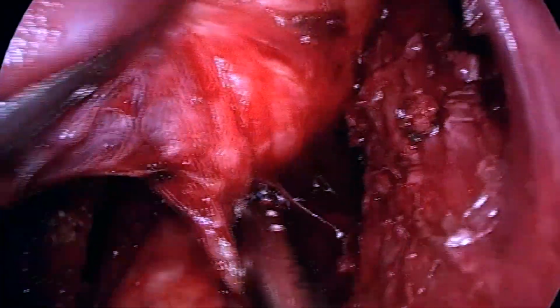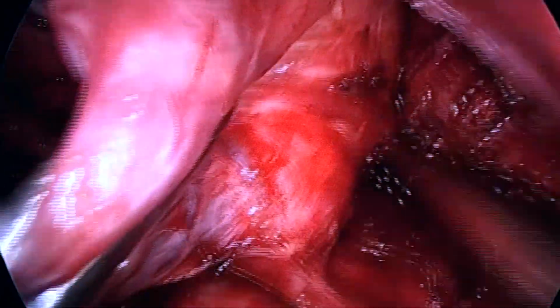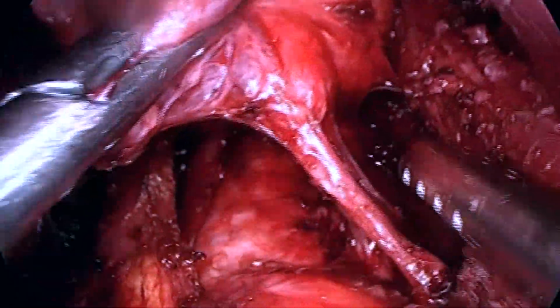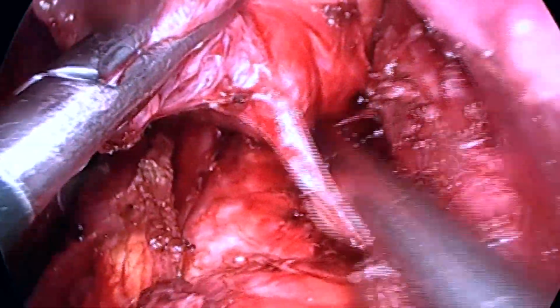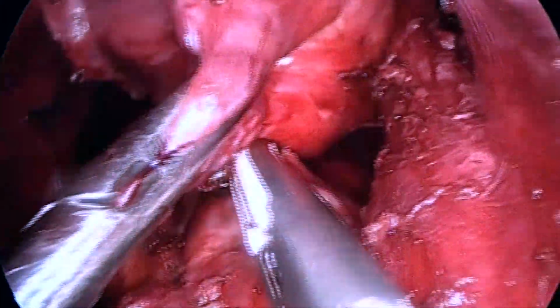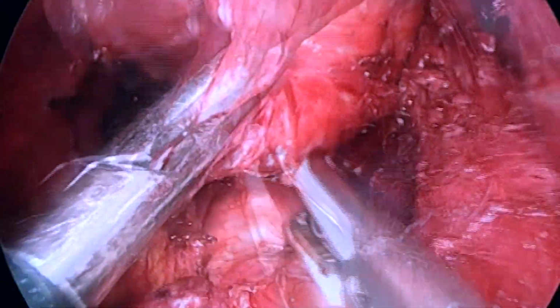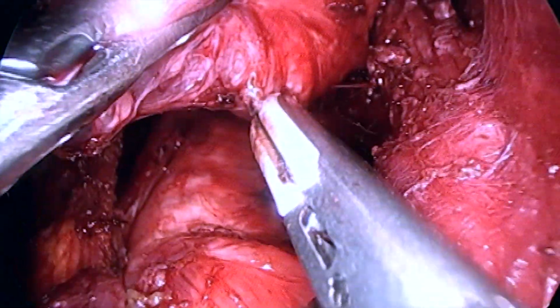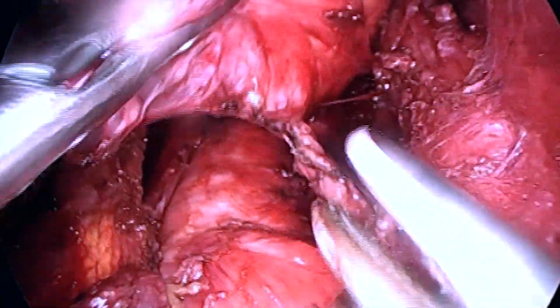The intracapsular dissection preserves the vascular supply to the parathyroid glands and allows for a very easy dissection of the gland. The vascular branches close to the thyroid gland are coagulated so that the vascular pedicles of the parathyroid glands are preserved.